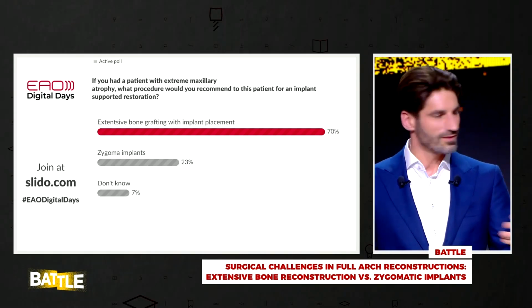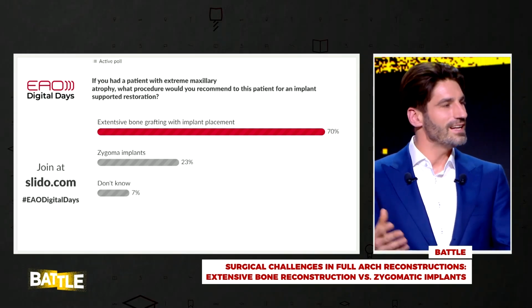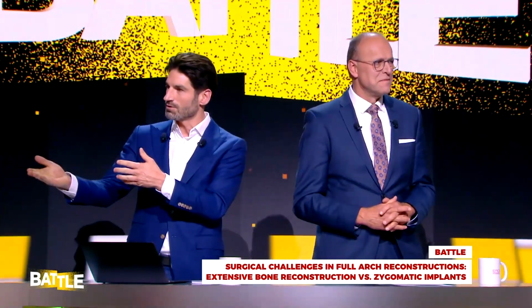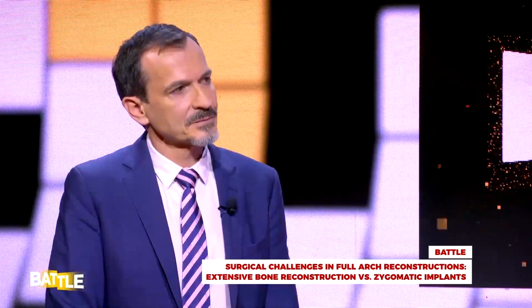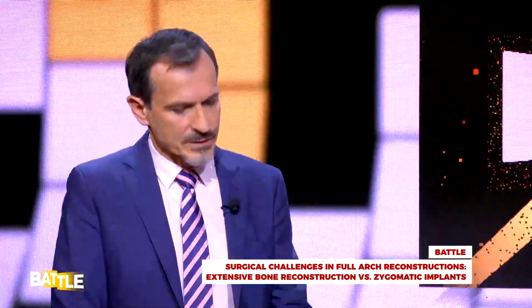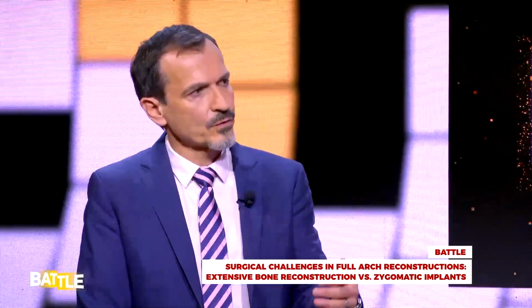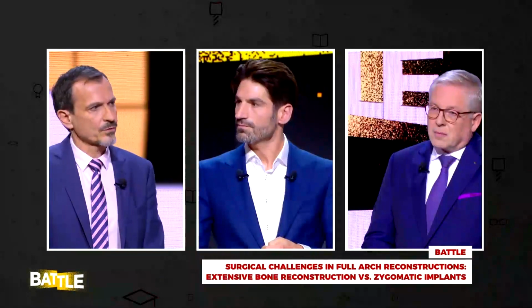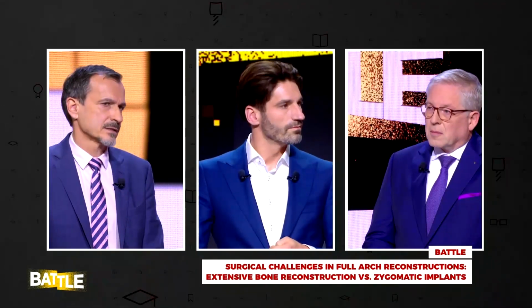And of course, sometimes that's needed. But is there any case where you would say, Hendrik, I would definitely go for zygoma, or vice versa, where you would say, now I would recommend my patient to go for bone remodeling? I would say that in younger patients, I would certainly go for bone reconstructions. And in older patients, I would certainly go for zygoma implants. That's what I can say.